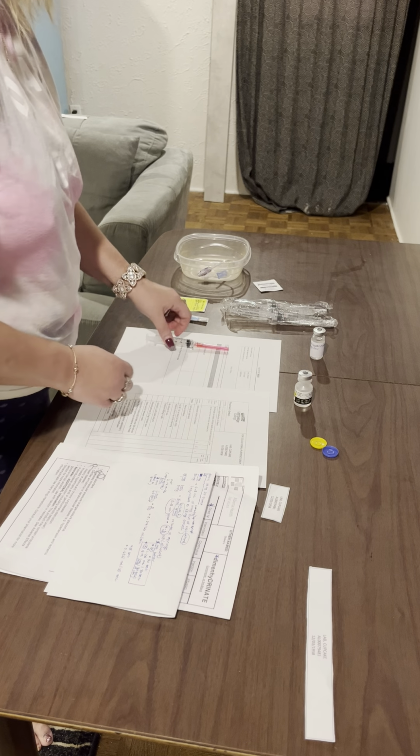So the next thing we're going to do is uncap this and draw up 4.5 for actually a total of 5. So I'll just put it in here, and as you can tell, it's springing back quite fast. So we will make sure this says 4.5, or 5, sorry, because we already have 0.5 in there, so we're drawing up 4.5 for a total of 5. As soon as we get there, I will let you know.